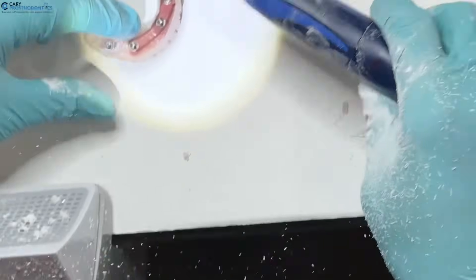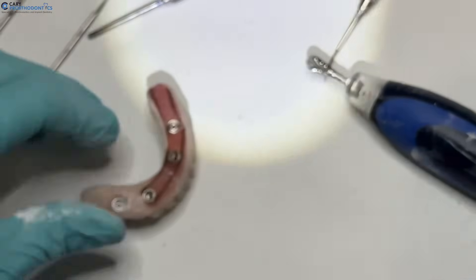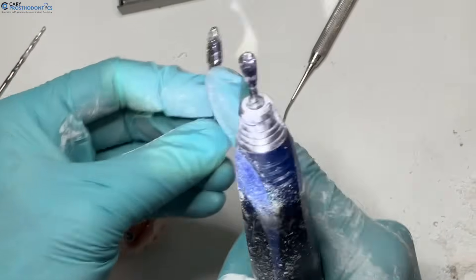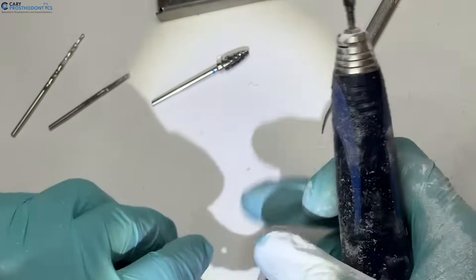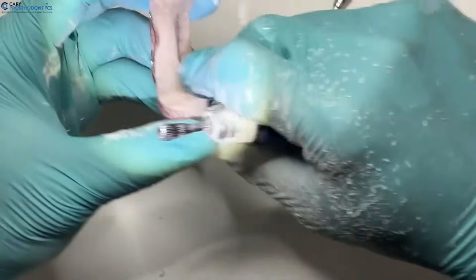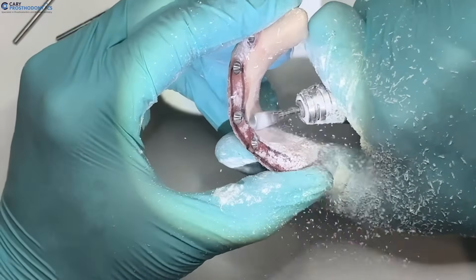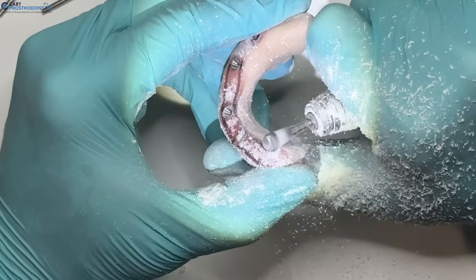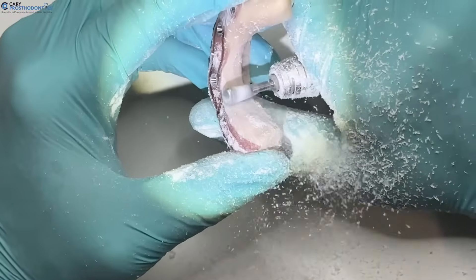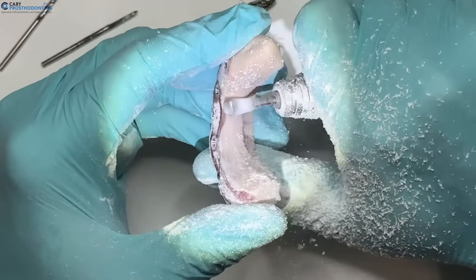With this burr, the model is pretty well debulked. For the next part you can use this drill or a pear shaper. I like the pear shaper for the lingual side to get a little concavity. I'll take it closer to the black line — I won't necessarily remove it, but I can really debulk everything here.